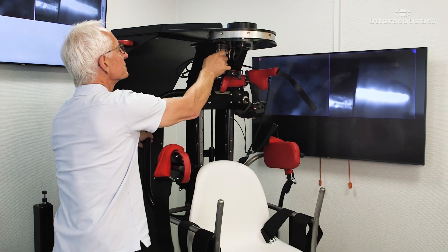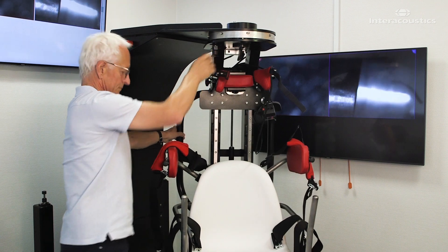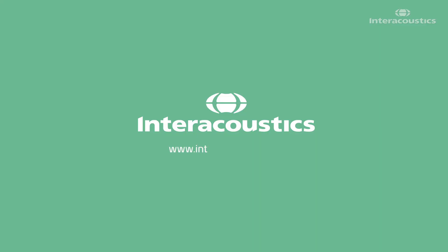Now you are ready to receive your patient.